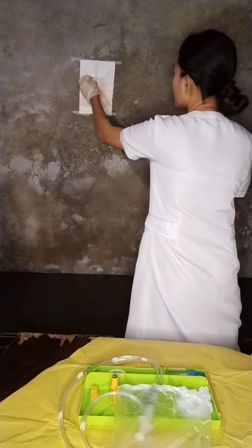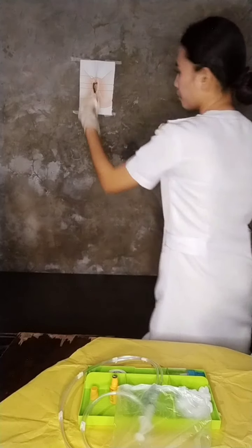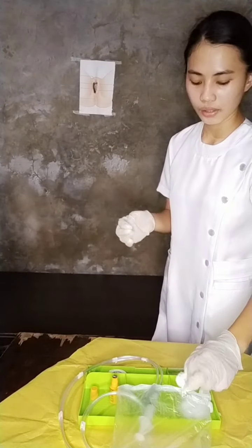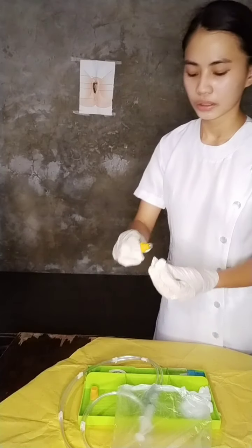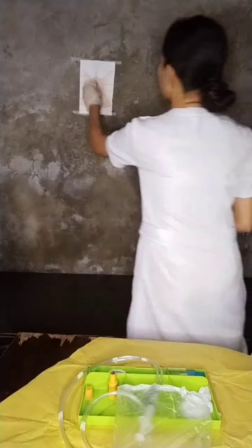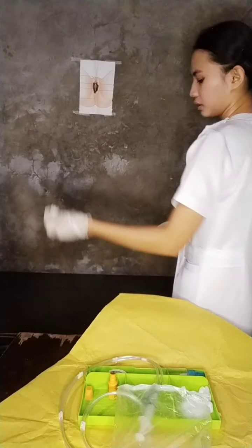So first is away from you, and then discard the first cotton, and then next is towards you, then discard.